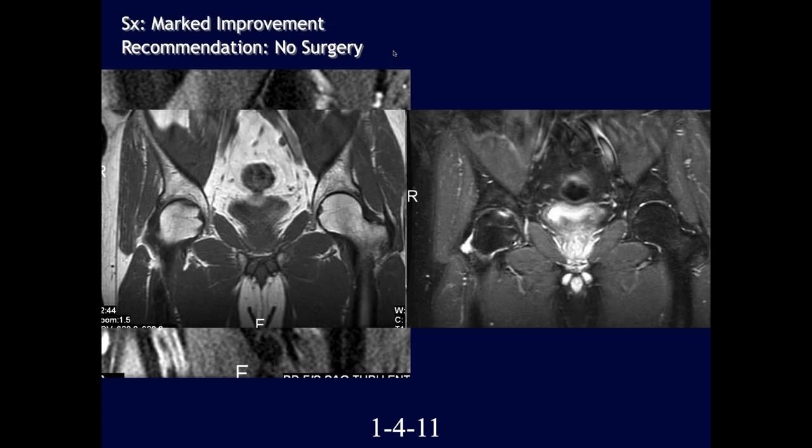And then he came back January 4th, 2011, so 2 months later. Here you can see most of the marrow edema actually has resolved within the femoral head, but there is some low signal still remaining along the superior margin of the femoral head with some low T1 signal and some increased T2 signal right there. It looks like it's healing, but I'd like to wait for a few more months. And he was markedly better at this point.